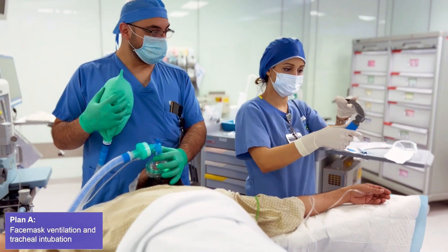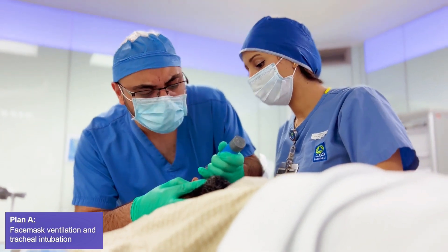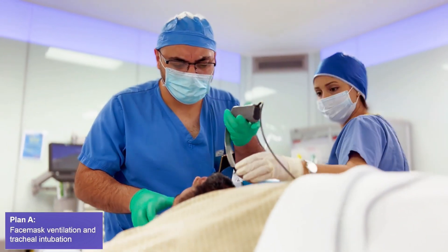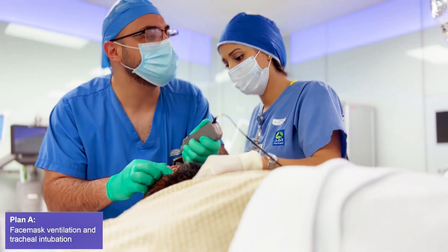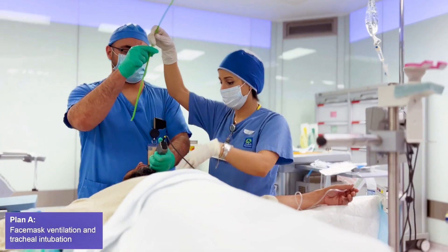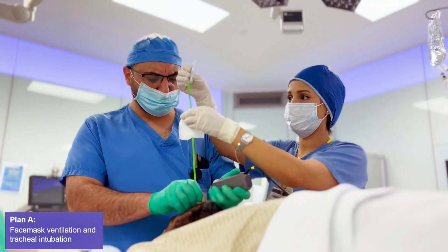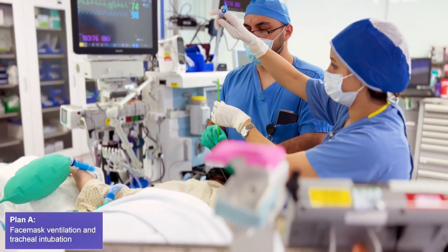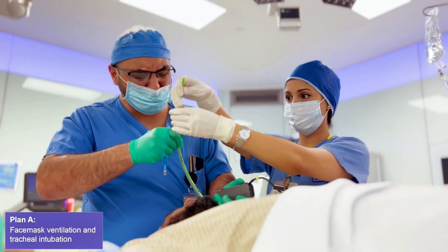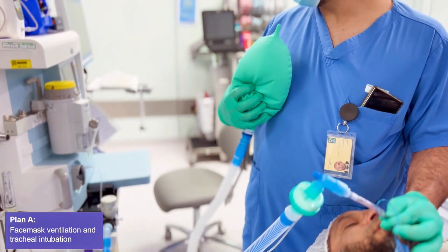It is recommended to begin by choosing a direct laryngoscopy technique with a standard laryngoscope as the primary approach. If direct laryngoscopy is difficult, use a video laryngoscope. When it's challenging to see the vocal cords during intubation, you can use a bougie as a helpful tool. The bougie assists in navigating and smoothly inserting the endotracheal tube into the proper position. Remove the bougie, inflate the cuff, and connect the circuit.